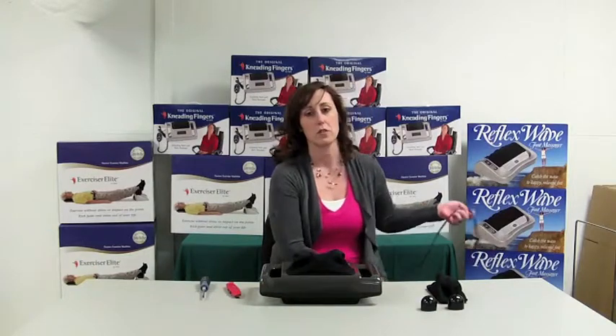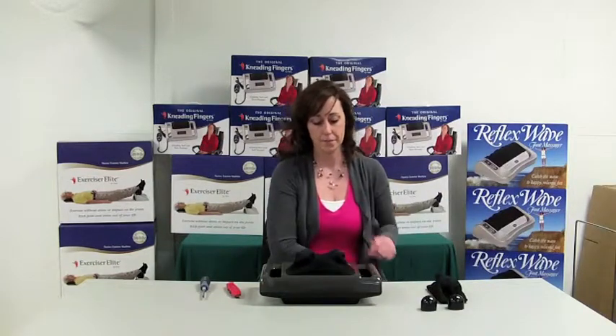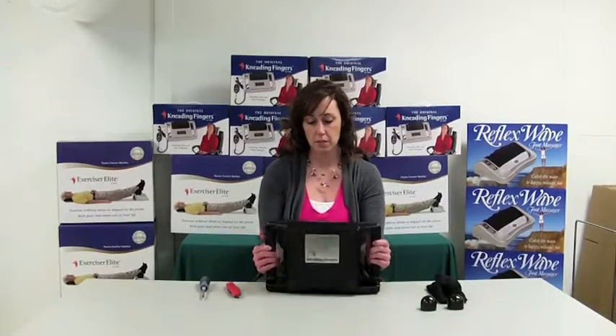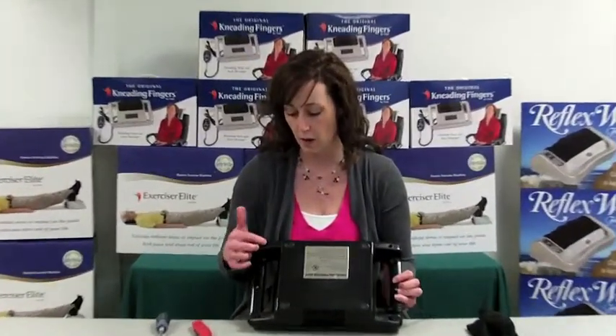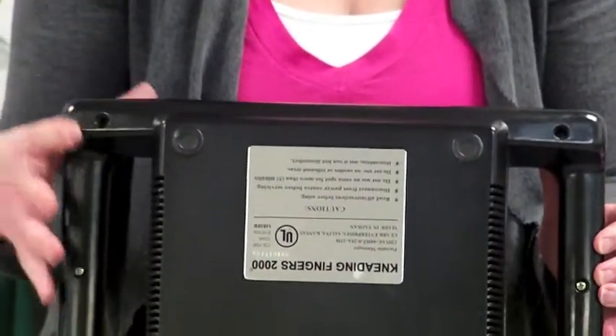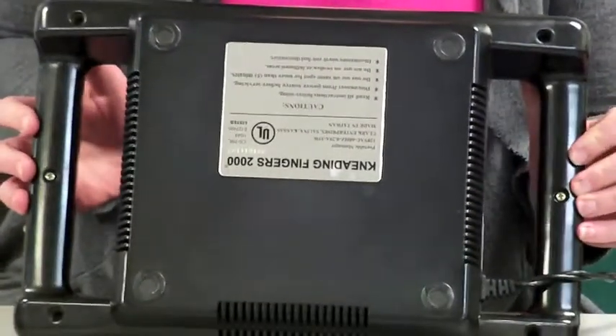First thing, make sure that your machine is unplugged. On the back side of your Kneading Fingers machine, there are six screws that hold the machine together. So the first thing we'll do is take those screws out.